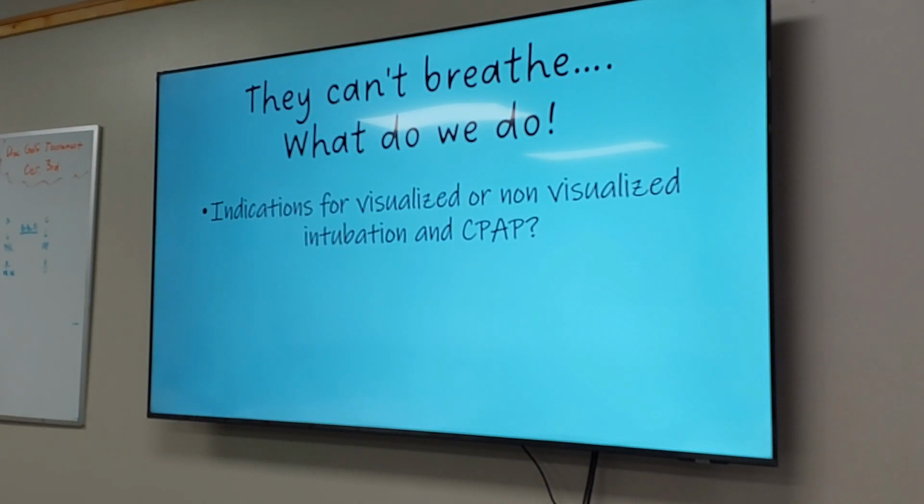What about blood pressure? Is hypotension a contraindication? Yes. Because what does CPAP do? CPAP will drop their blood pressure. It'll increase the intrathoracic pressure, right? So it has to be over 100 typically. Also, they need to be responsive. You can't put CPAP on somebody who is unresponsive.